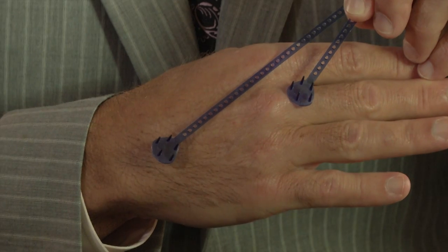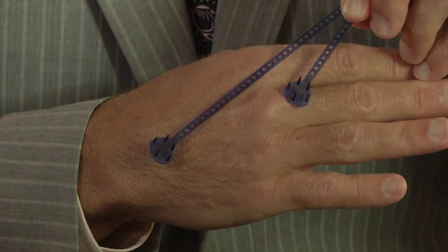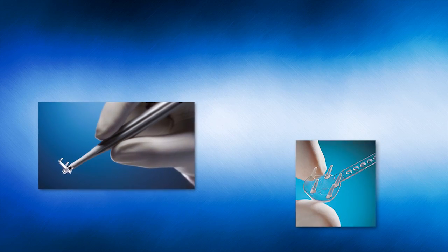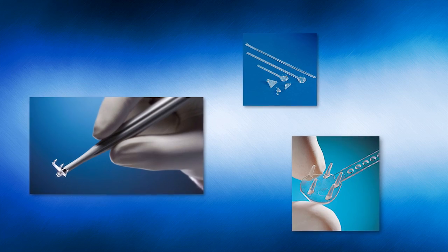And the way we keep that in place now is using the Endotine device. What this is, is a dissolvable soft tissue anchor that allows us to go underneath this area, and it really helps secure that cheek in the elevated area.